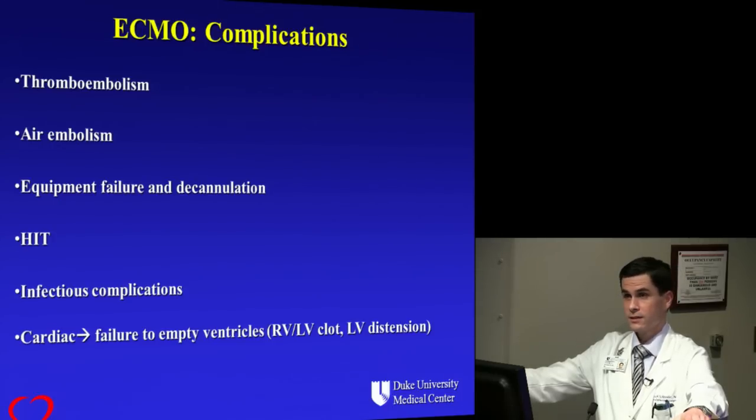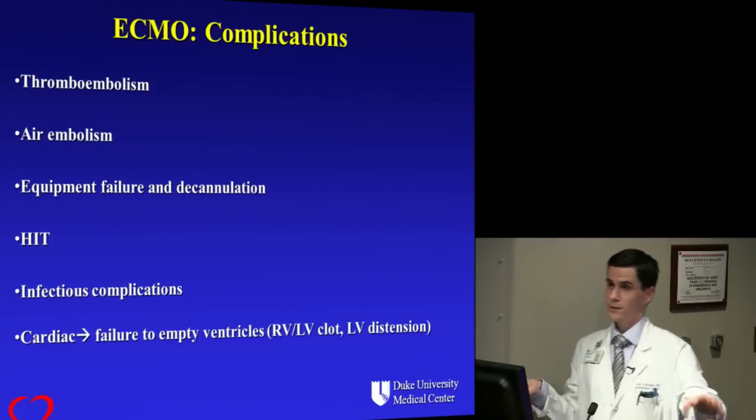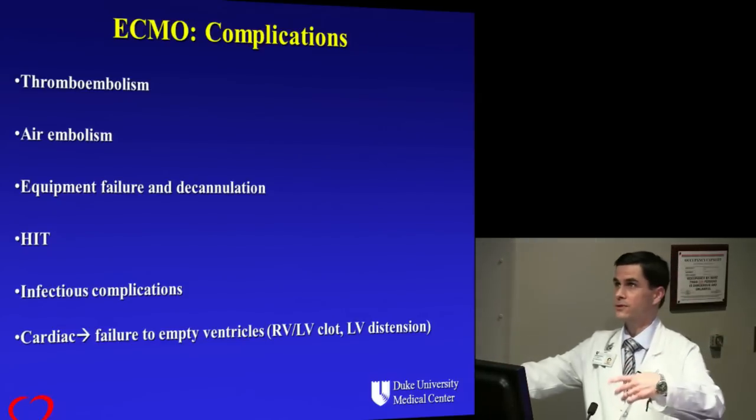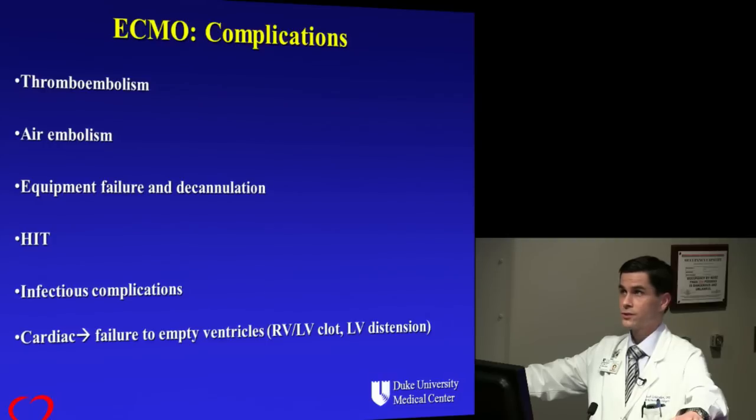So, you see in the ICU or in the operating room where we have a patient on ECMO, and you watch the IV tubing and there are air bubbles just running in, and I think it's one of those things that you have to be much more vigilant about, because those air bubbles are going to cross straight over through the filter of the lungs and go right to the arterial circulation. And I don't think we have a documented case of massive air embolism, but it could happen.